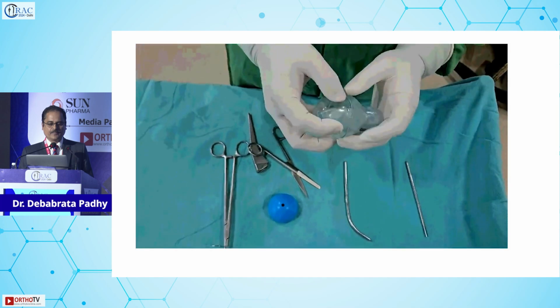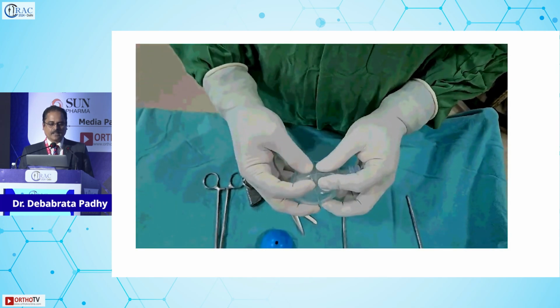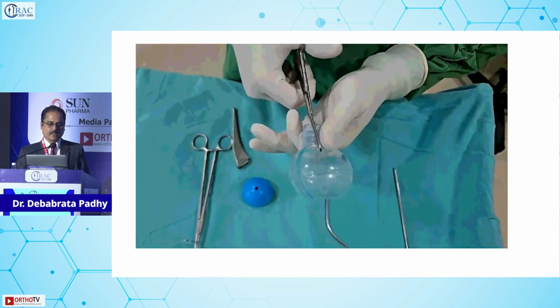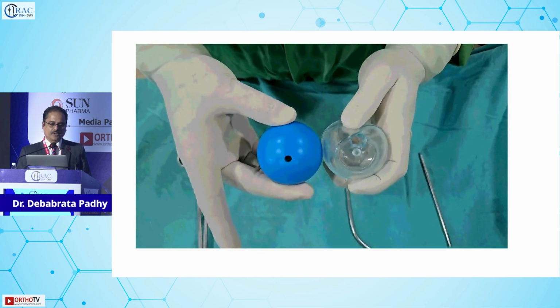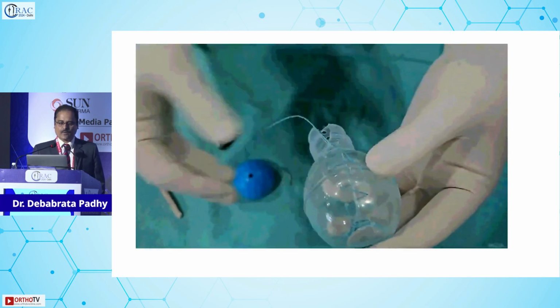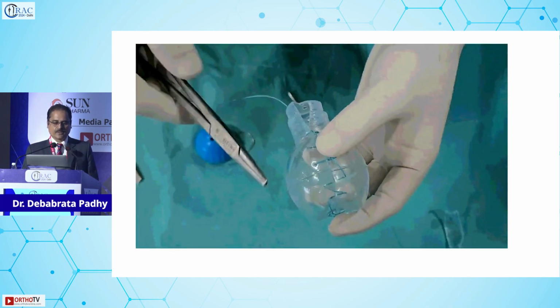So we overlap the cut head, and the size of the head obtained at the amount of overlapping is cut, and we can see that the head size is almost equal to the desired head. And then we suture it with any suture which is available.